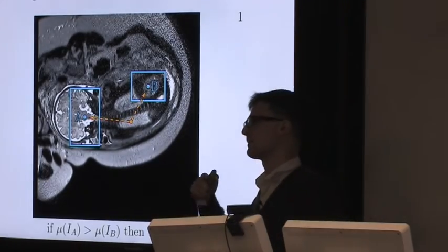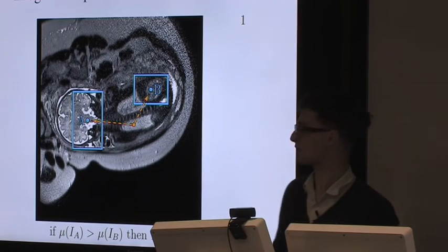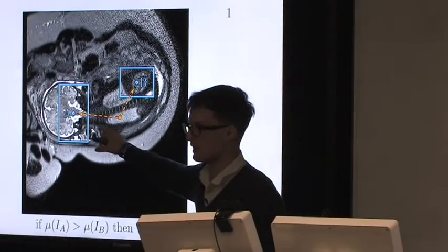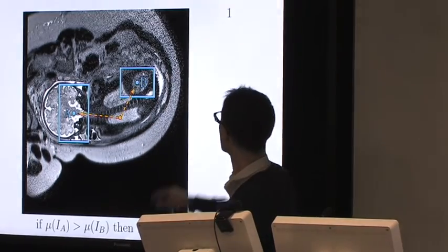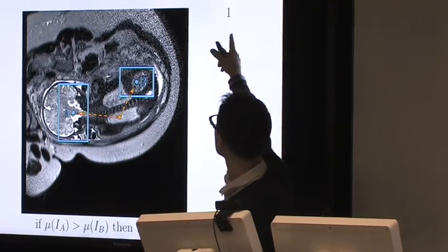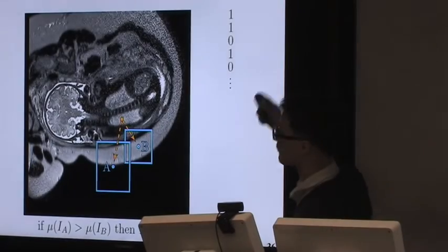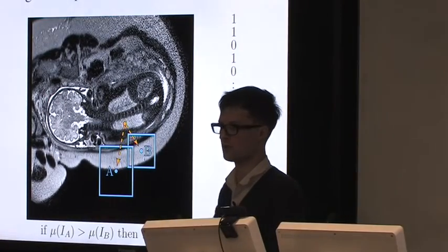And when you do machine learning on images, you need features. You can't just use pixels like this. So the kind of image descriptors I've been using are mainly simple difference of mean intensities. You take one 3D patch, another 3D patch, both at a random offset from the current pixel. You check, is the first patch brighter than the second patch? Yes, it gives you 1. Another patch, it gives you 0, and so forth and so on. And that way you build a descriptor, and for this pixel, this will be the input of your machine learning algorithm.